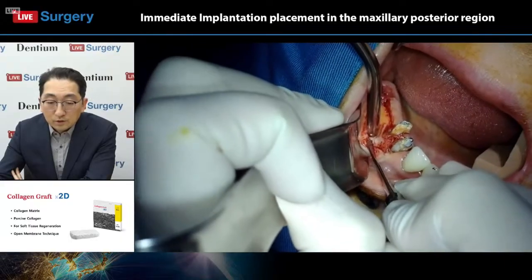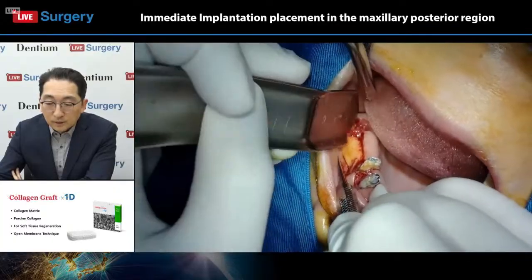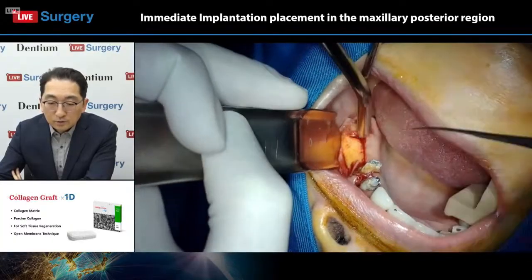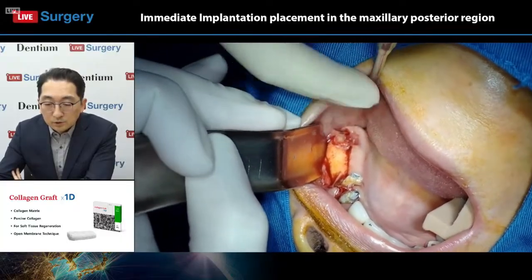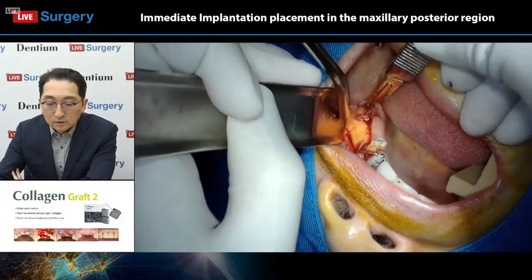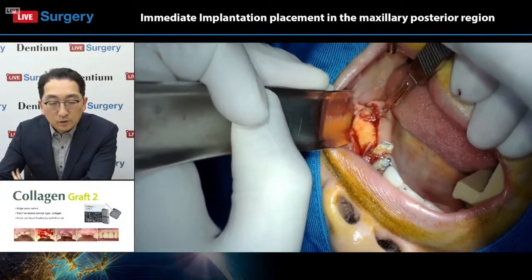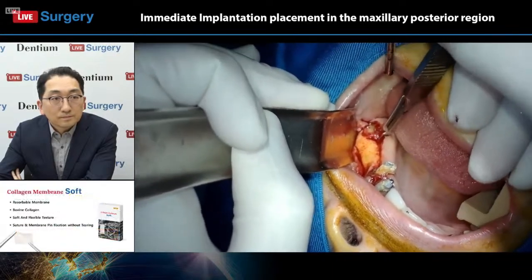Once you draw the incision line as cleanly as possible with a blade, then use a curette to sever the periosteal attachment along the irregular bone beneath the incision line. The flap will open on its own, like that.